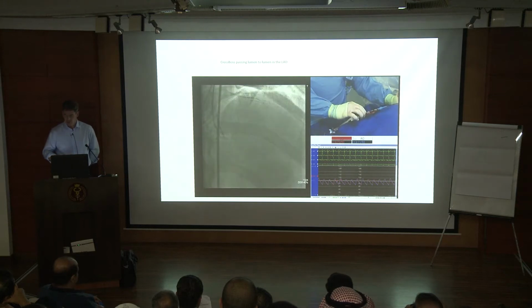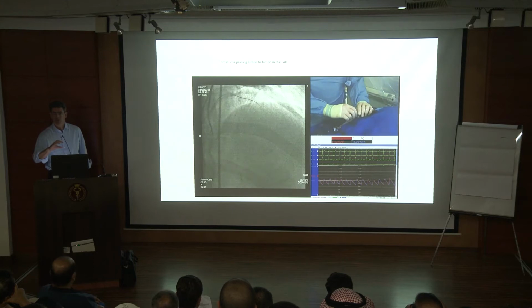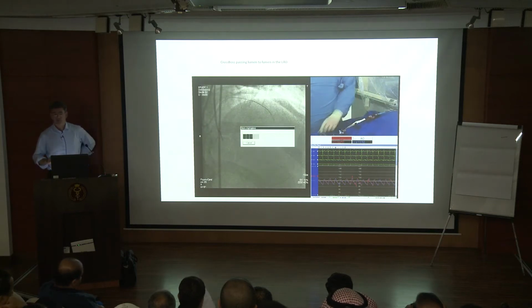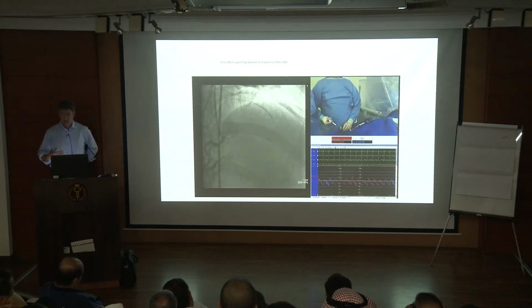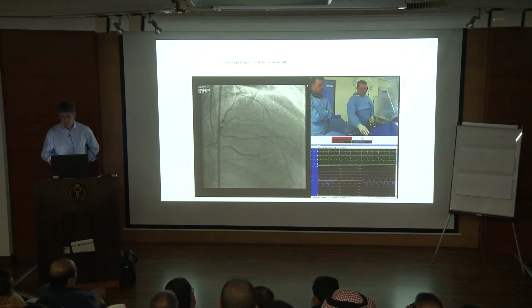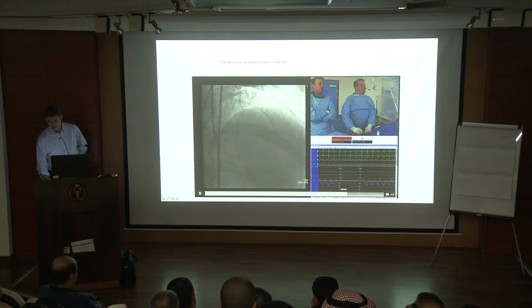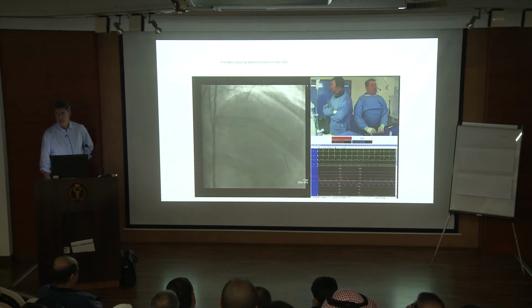The friction is reduced, and it will act as a blunt dissection tool going through the lesion, maintaining an intraplaque position in this particular case, and there you see it's jumped through the distal cap into the distal vessel. Essentially in that situation it then just becomes a microcatheter, and you then have to change out. The position is good, and the wire goes into the distal vessel, and that case is done extremely efficiently and quickly.